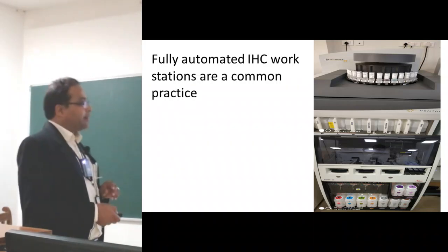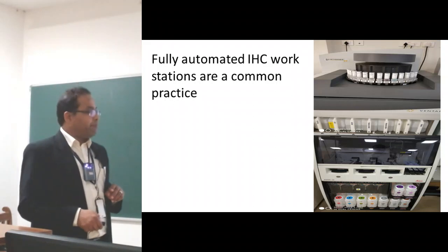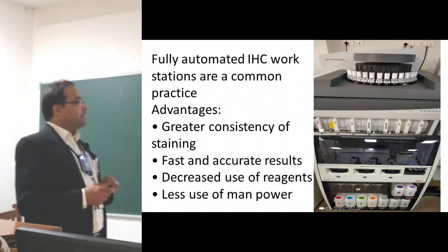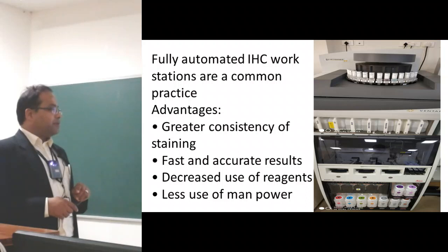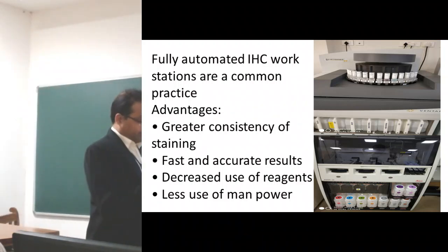This is the automated IHC workstation. We have 4 of them. The advantages are that there is greater consistency of staining here. There are fast and accurate results and decreased use of reagents, with less use of manpower.